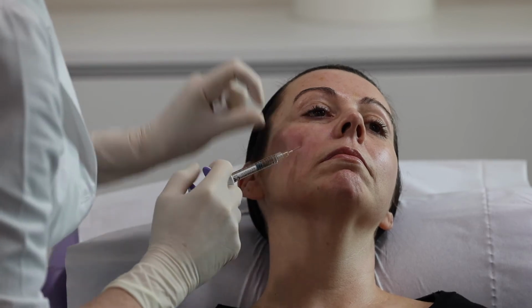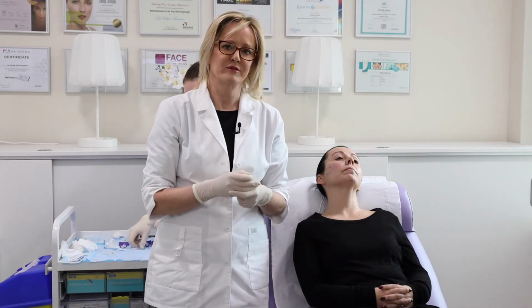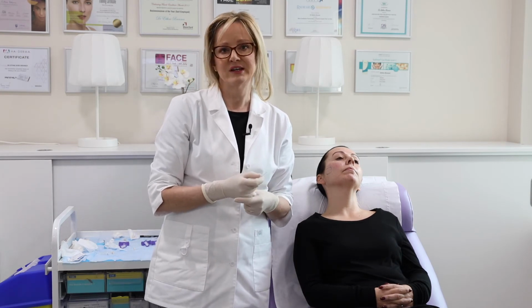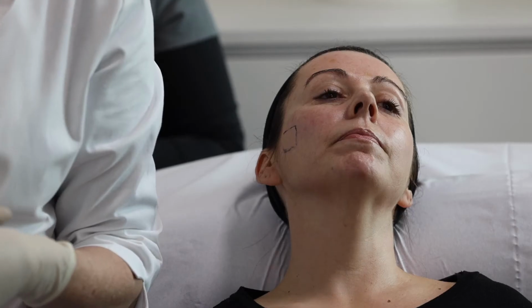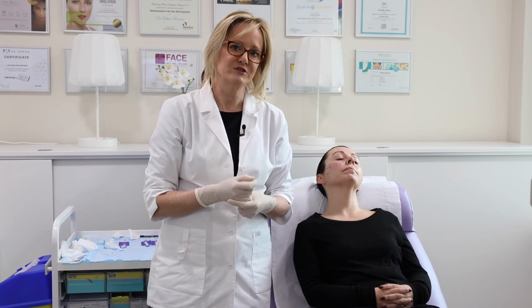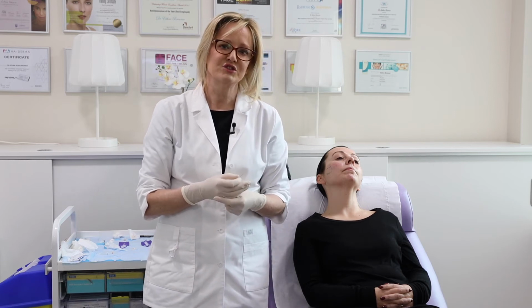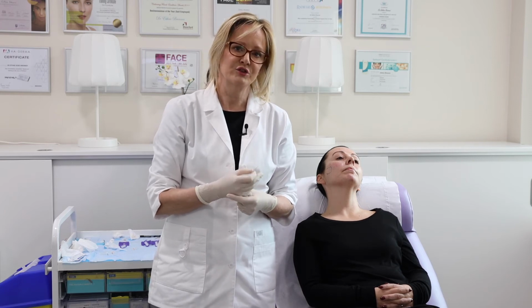Now I've marked CK4. This is the lower border of the zygomatic bone and the anterior border of the masseter, and I've drawn a rectangle. I'm going to use some Volift on a cannula here, 0.5 cc's, in a fanning method, and I'm going to be above the parotid, so I'll be subcut but relatively superficial. I want this to give some lift and contour and slimming of the face. I'm going to use Volift.